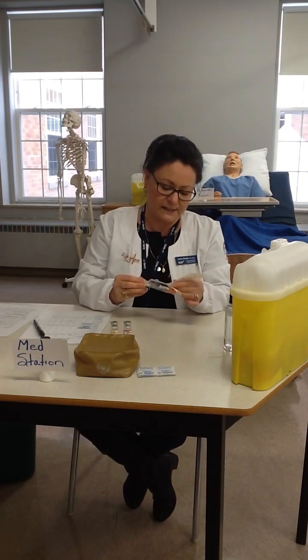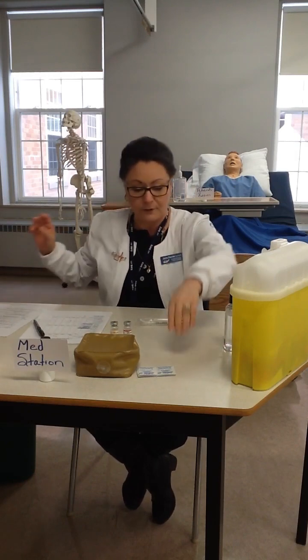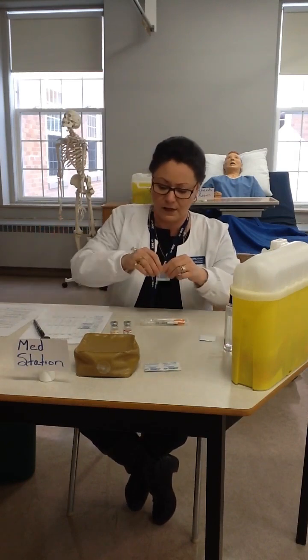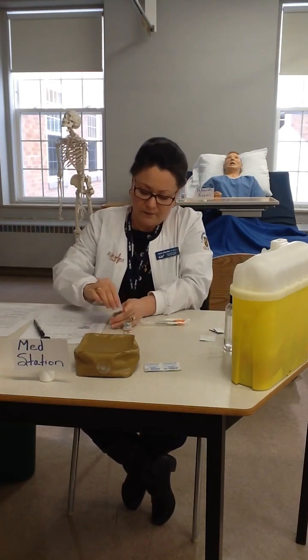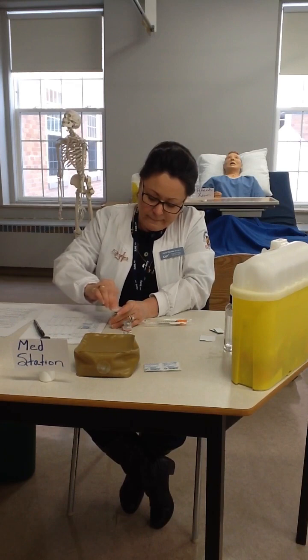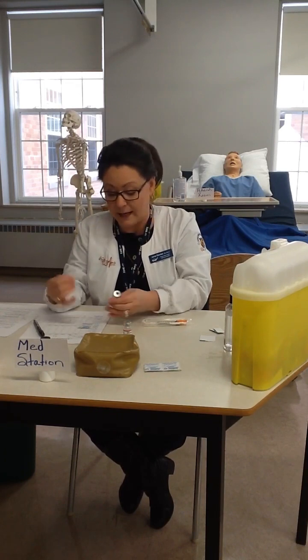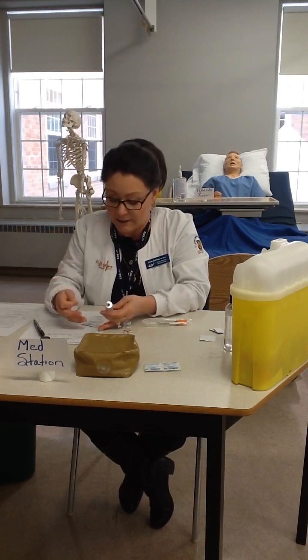I think it's fine to do whatever works for you. I'm going to go ahead and take a swab here, and I'm going to swab both of my vials, give them a good scrubbing. And while I have it in my hand, I'm going to go ahead and do my second check while it's drying.